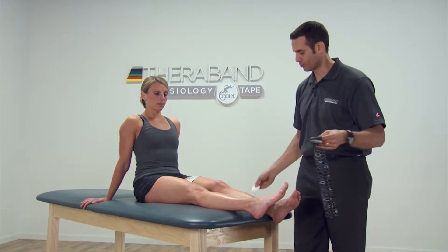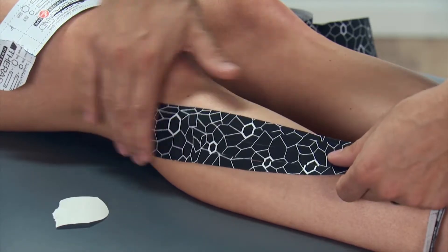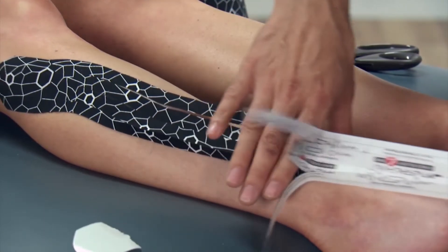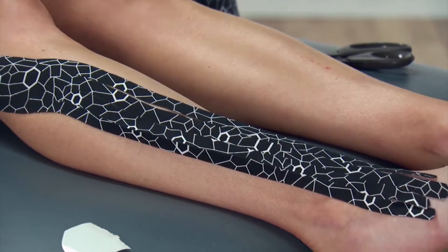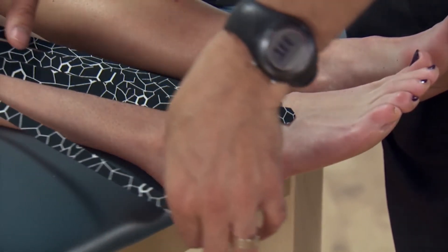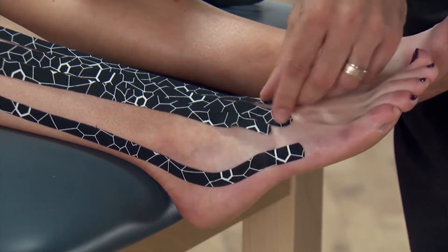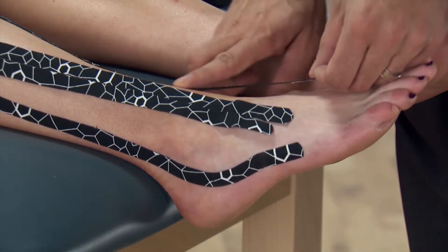We're going to peel off our backing for our first strip and apply it to the posterior lateral aspect of the knee, which is where the lateral ankle drains. We're going to stretch the tissue, and now we're going to peel off those backings and just tap it down towards the end of the ankle. With each individual tail, because we left the backing on it, we can manipulate each tail easily all the way down onto the dorsum of the foot and just peel the backing off at the very end. I always start with the inside and the outside ones first.